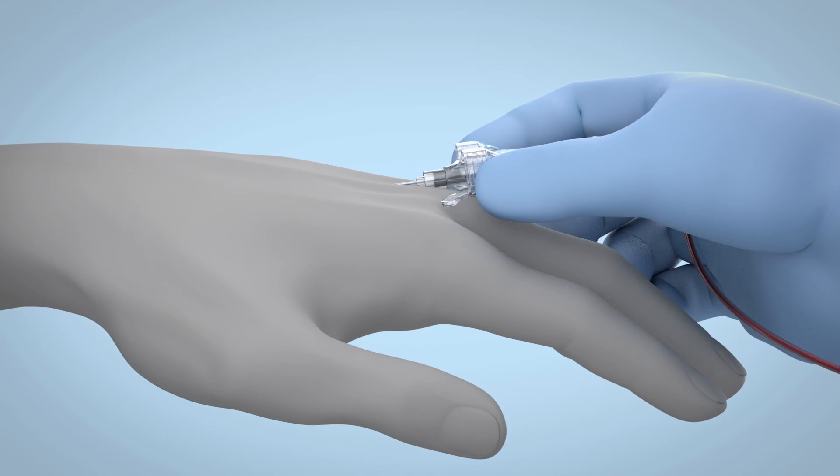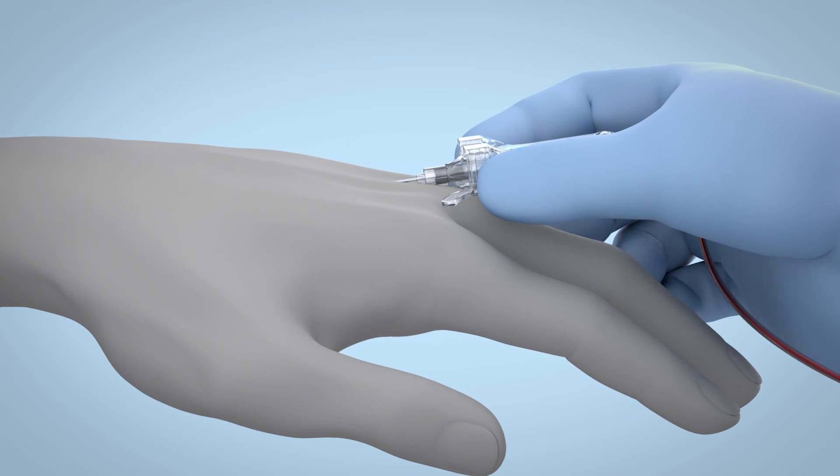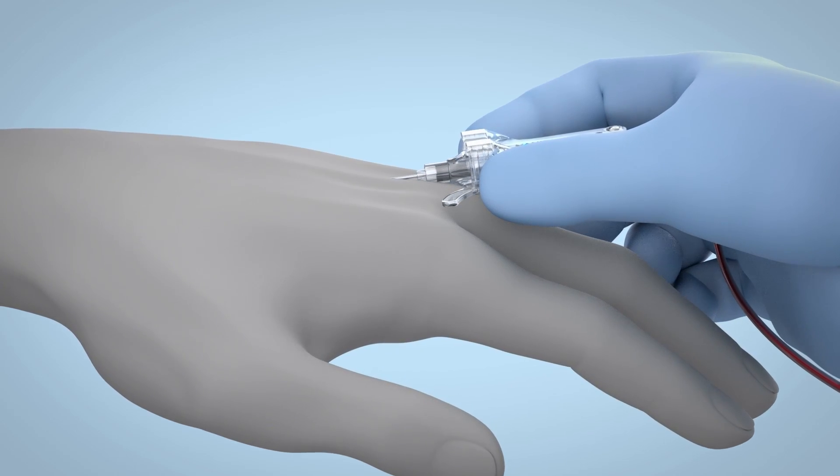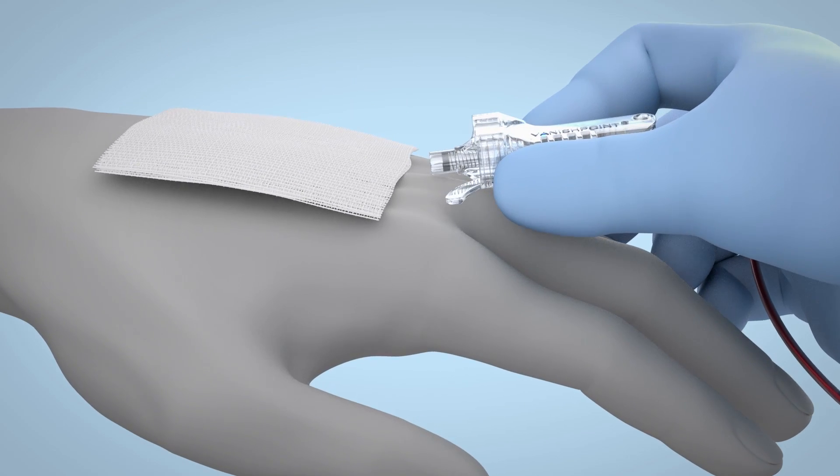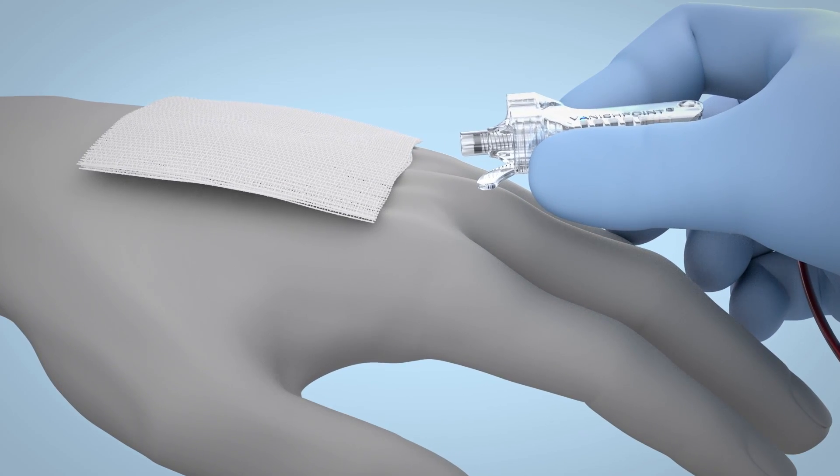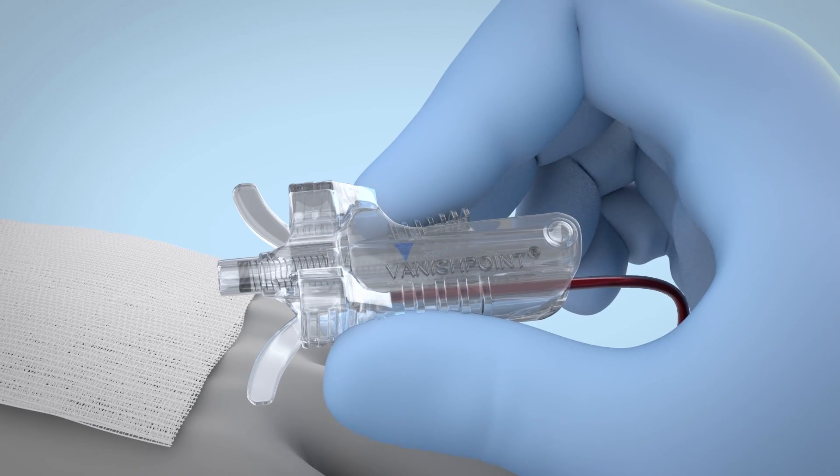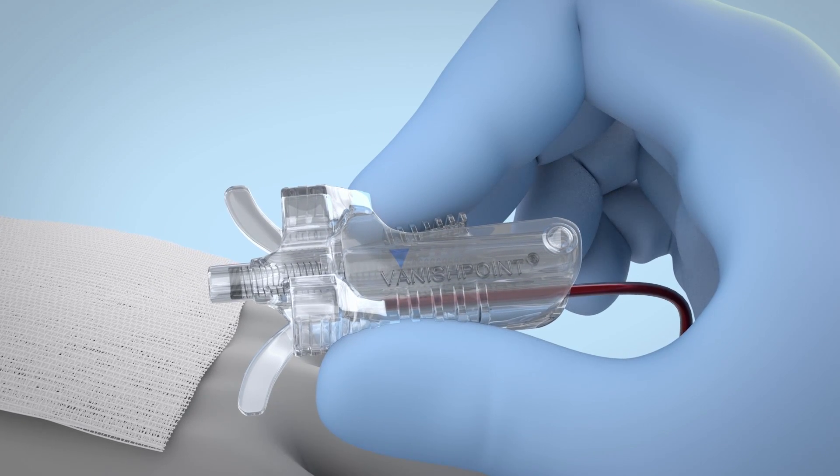When blood collection is complete and while the needle is still in the patient's vein, firmly depress the retraction trigger. Activating the retraction mechanism while the needle is still in the patient's vein virtually eliminates exposure to the contaminated needle.